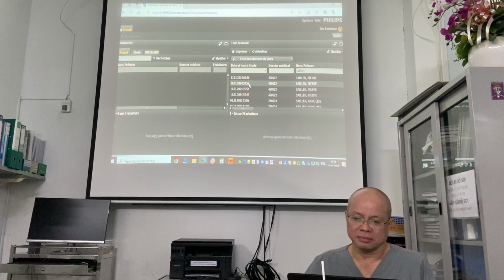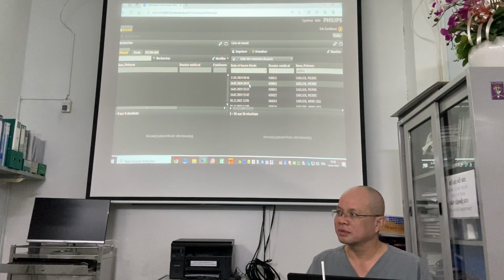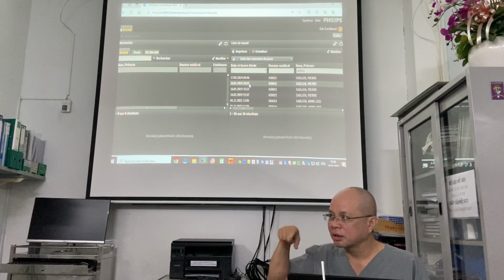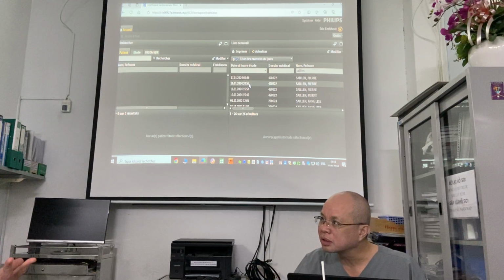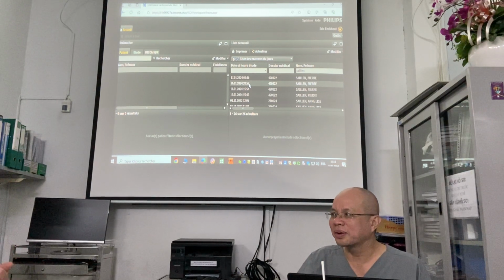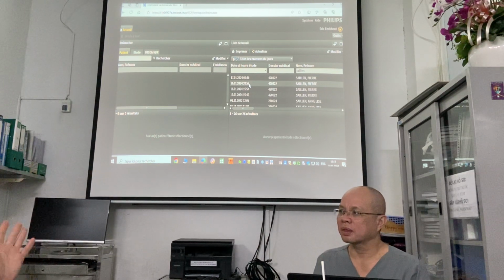So I do it in the cath lab because it's elective. The most important thing, after the local anesthesia, is really to puncture horizontally. The complications occur when people puncture too tangentially. You can go in the liver, you can go in the right ventricle, you can puncture the right coronary, you can puncture the left coronary when you do transapical. You can have all kinds of complications.